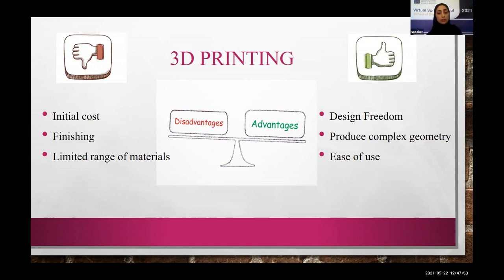The other advantage is ease of use. The complexity of this system is in designing the STL file. Once the file is virtually loaded, it is just like a click and the fabrication commences. The 3D printing disadvantages are as follows: the initial cost, needing some finishing and post-processing steps, and the limited range of material.